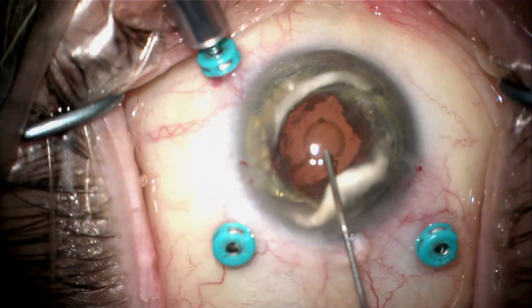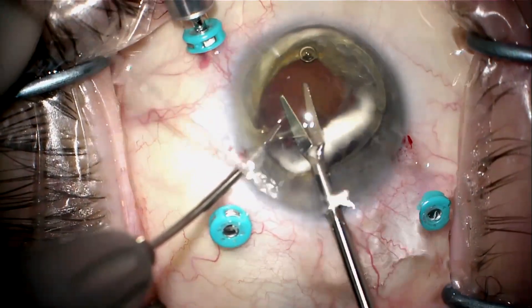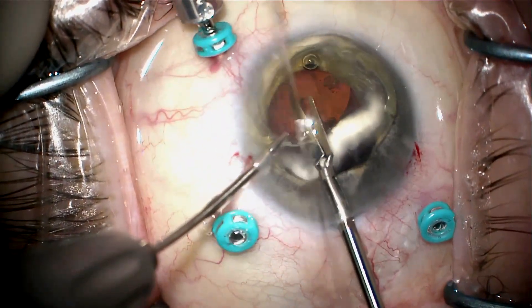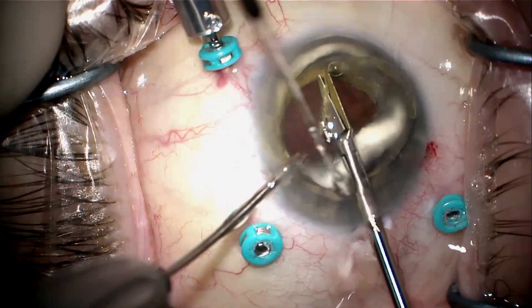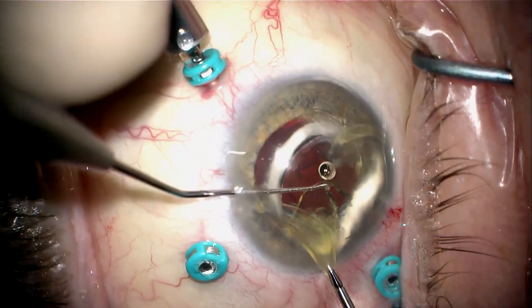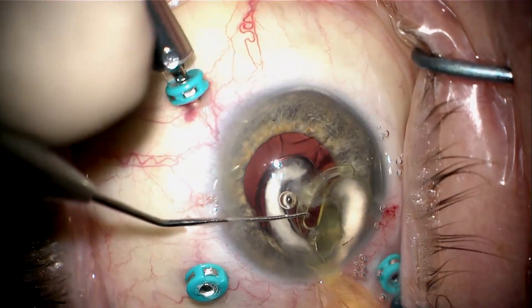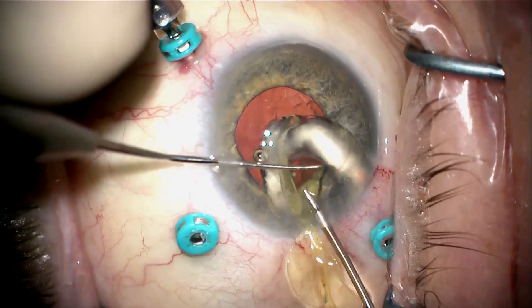I'm now going to shut the infusion off, add viscoelastic to protect the cornea, and cut the lens 90% of the way through — just leaving a tiny hinge, as you can see right here. That means when I pull this half of the lens out, the other half will follow and not fall posteriorly. I can go ahead and grab it and pull it out.